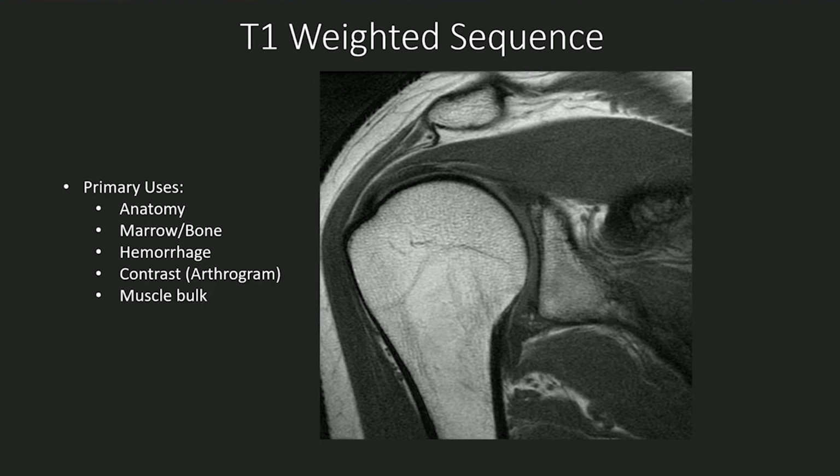And to simplify it, and I think for the purposes of just making diagnosis, there's no need to have a complex understanding of it, but we're able to create our own soft tissue contrast through the use of these sequences to diagnose things. And the most common sequences that we use are divided into two main categories: fluid sensitive and T1.